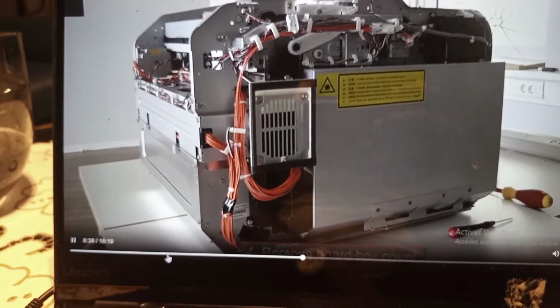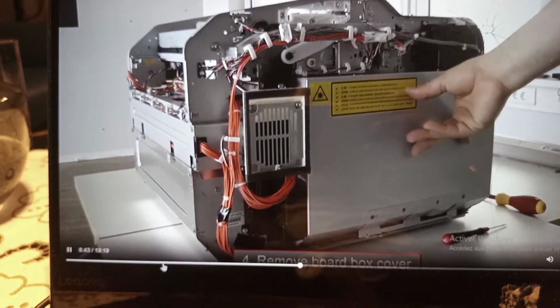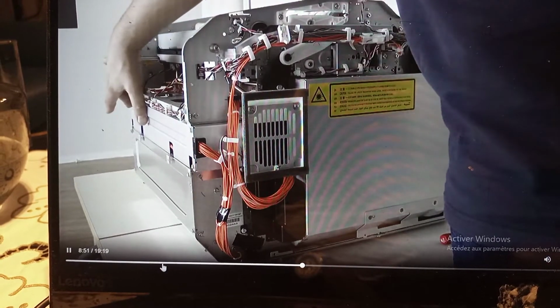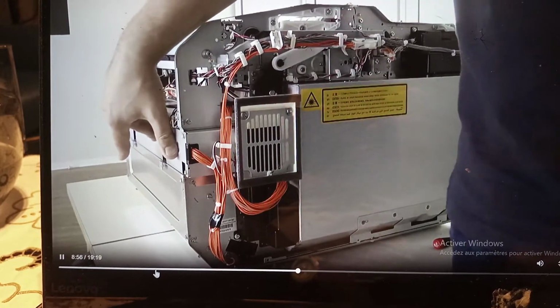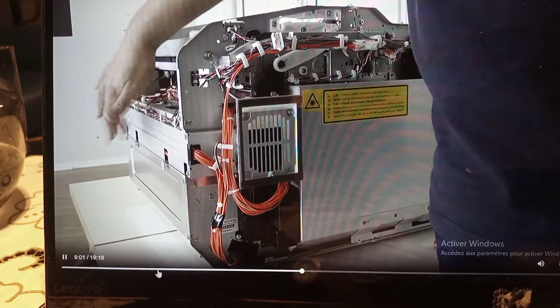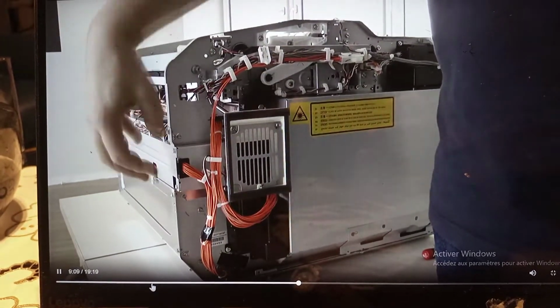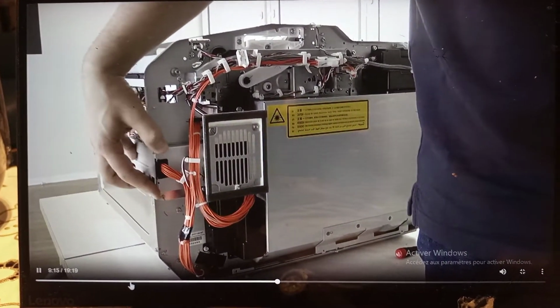After that, we want to show the 4 main boards in the device itself. At the front we have this compartment here, it's a power supply compartment. We have on the left side the power supply board, and on the right side the power distribution board. So in case of changing one of these 2 boards, it's just needed to remove all the attached cables from the device and loosen 4 screws, and then you can remove the complete power supply compartment from the device in this direction.